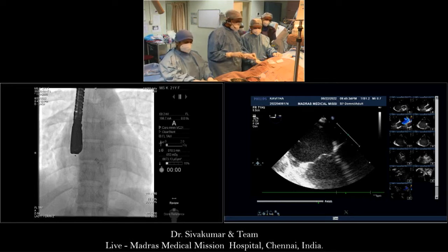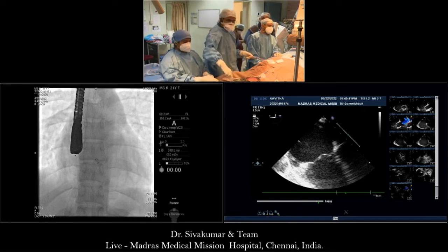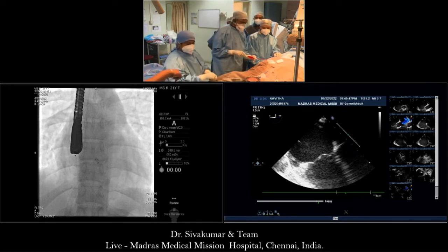That's exactly right, Siva. You've had a great educational session here. You chose a device size that has some issues with it. We've chosen a device size that's fallen out. And so your issues are much more than our issues at the moment. So when you do the 40 again, do it better than the last time.